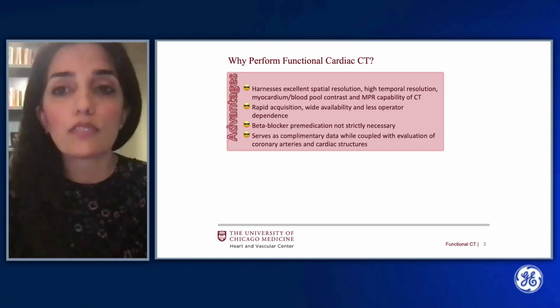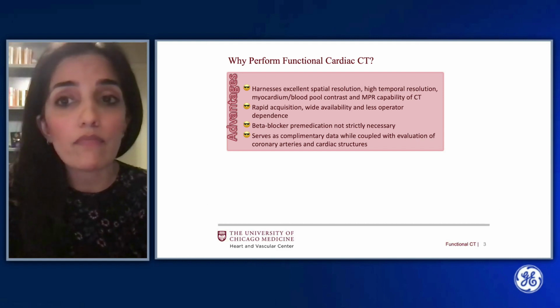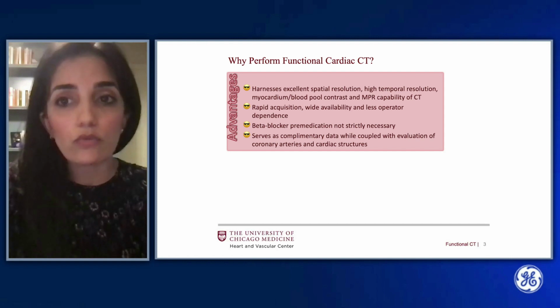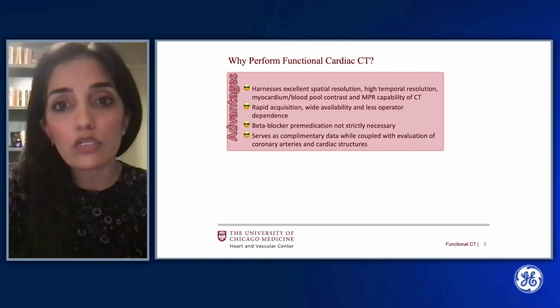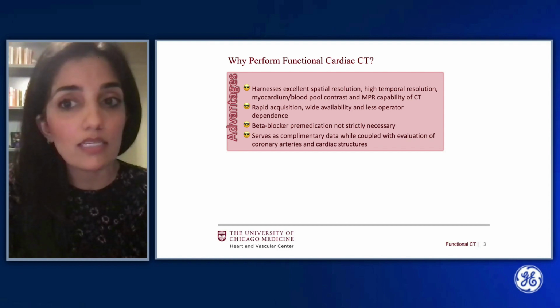Before we discuss the specifics, I think it's worthwhile to review why perform functional CT at all. There are clear advantages, the first being that it harnesses the excellent spatial resolution, high temporal resolution, good myocardial blood pool contrast, and multiplanar reconstructive capability that we know and love about CT.